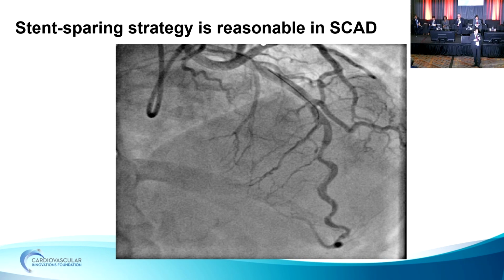Now that intimal flap may stay there for the long term, and late angiogram may not tack up, but the patient will do very well clinically. And I don't think this should be stented. Balloon angioplasty alone is a very reasonable option in spontaneous coronary artery dissection.